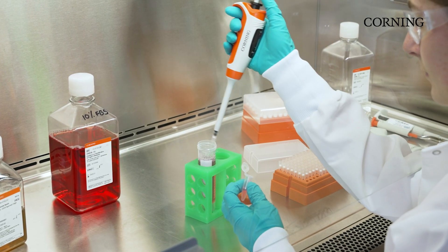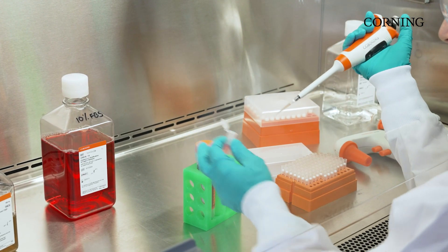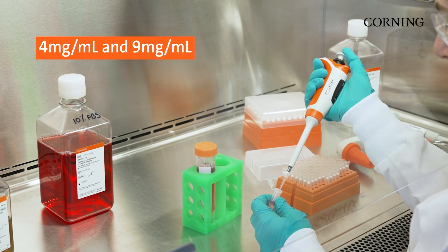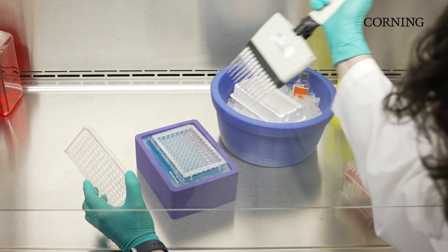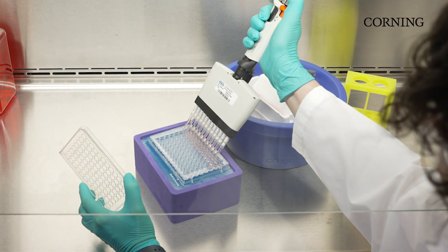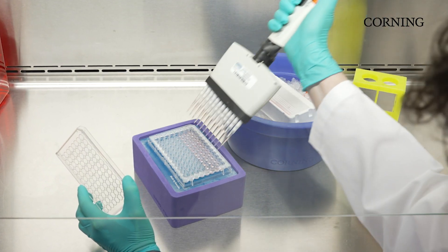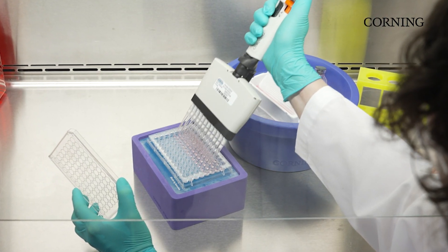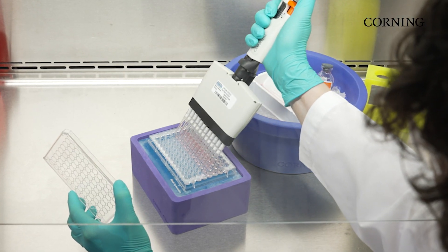With an embedded technique, cells are mixed with Matrigel Matrix at a concentration typically between 4 and 9 mg per ml. This Matrigel cell suspension is then pipetted into cell culture ware and allowed to polymerize, which causes the cells to be fully encapsulated. This is a great technique to expand three-dimensional cell cultures for homogenous assays or protein extraction.